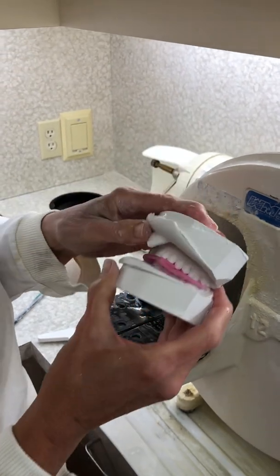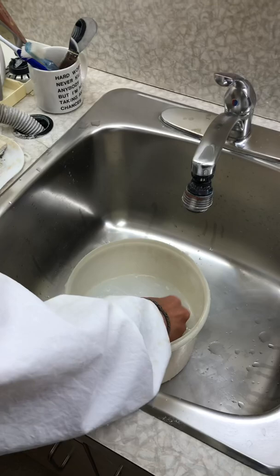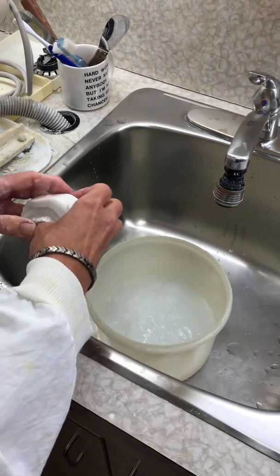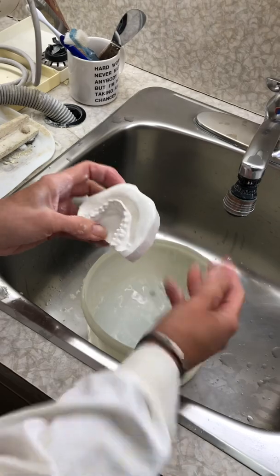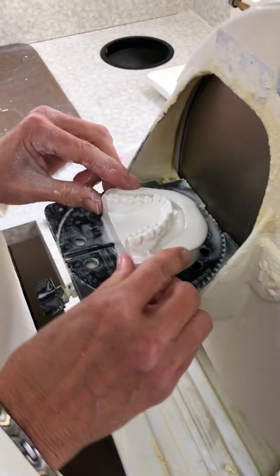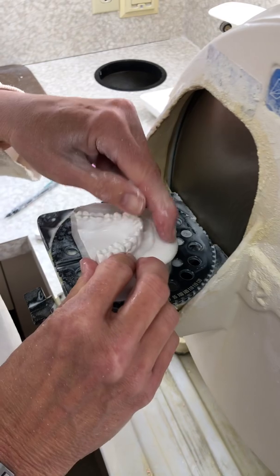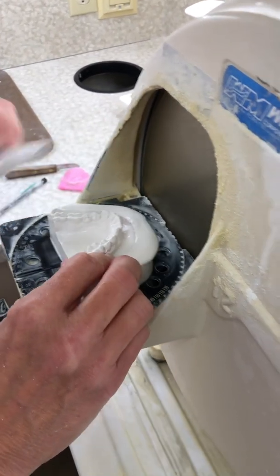All right, so now what we want to do is I'm going to again throw them back in the water, and we really don't need the wax bite anymore. We're kind of done with that. So now what we need to do is put our angles into the models. So take the model on the bottom. You'll do 115 on the heels, 55 on the sides, and then on the bottom we'll just do a curve across the top. So again, back to this guy.